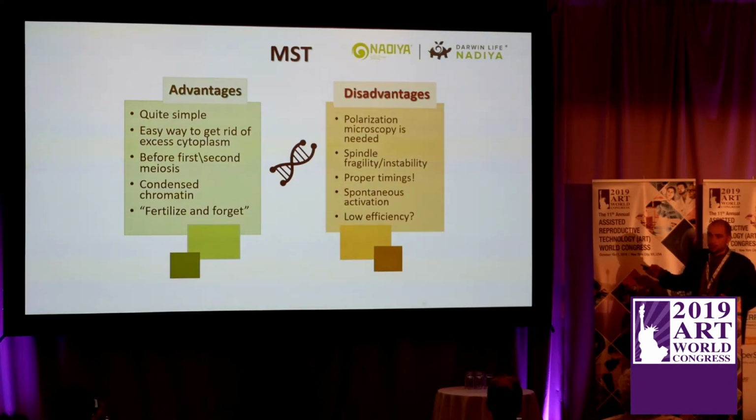It's for both of them, for M1 and for M2 spindle transfer. So you definitely need the polarization microscopy. And you need the proper timings, because your ooplasm could be spoiled with time. And there is a problem with spontaneous activation, and another problem that's not here, it's cytoplasm leakage, and Nuno will tell me the secret, how to prevent it.